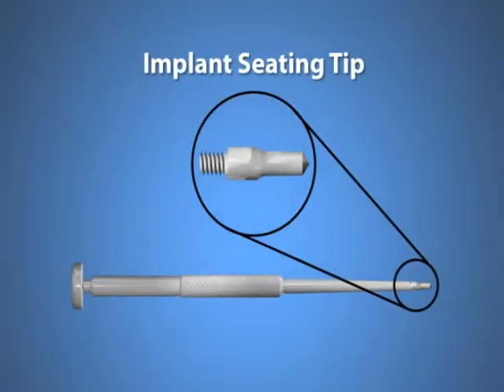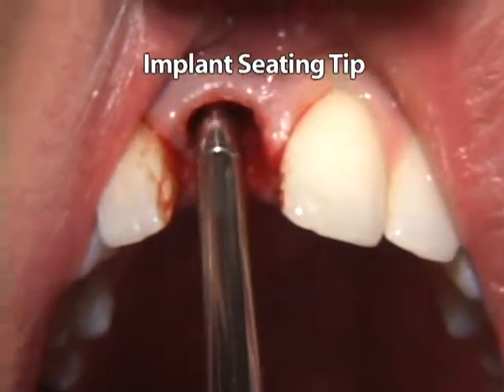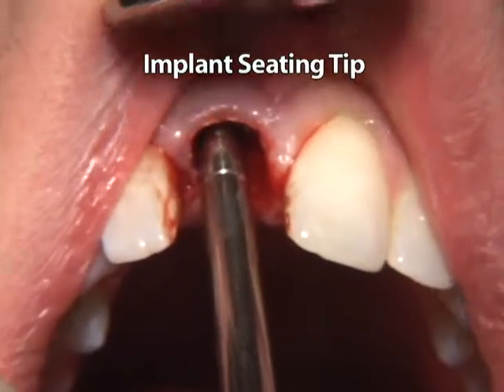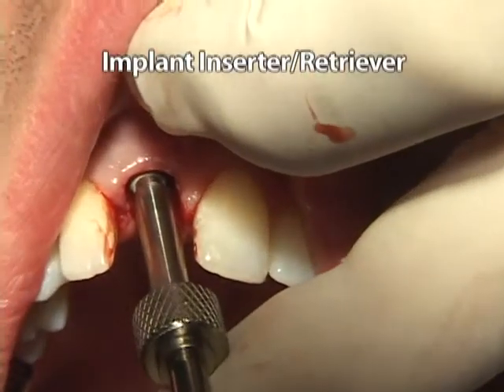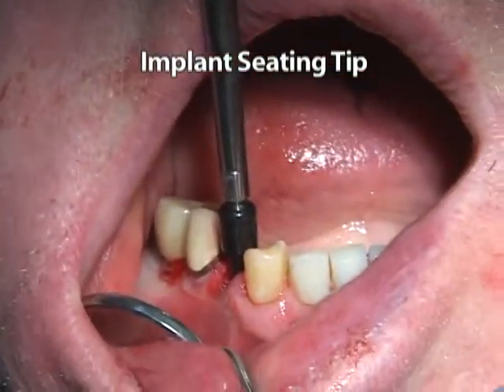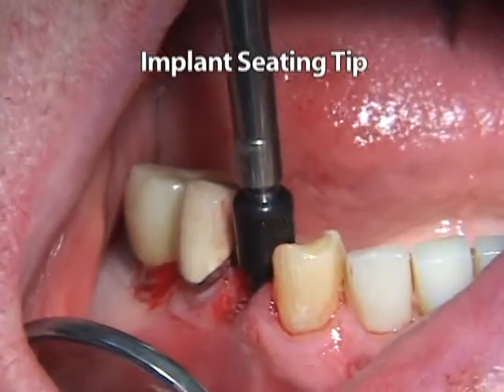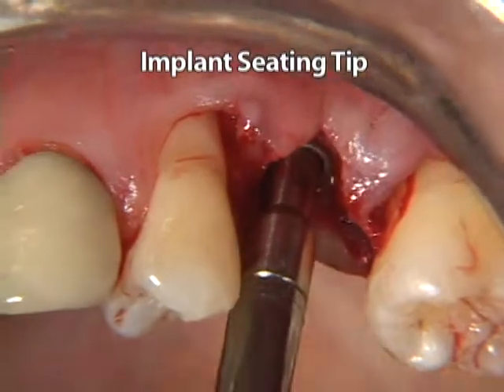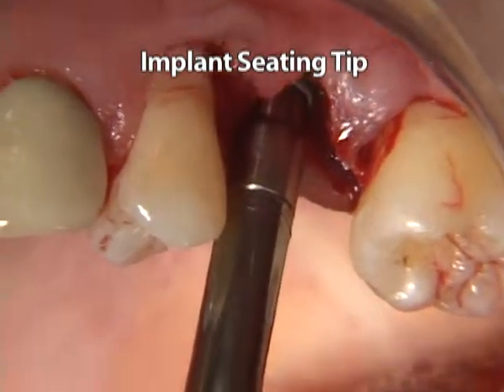After its initial insertion with a twisting and pushing motion, the blood-wetted implant may be definitively seated by tapping on it with either an implant seating tip or an implant inserter retriever instrument attached to a straight or offset handle. The implant seating tip may be inserted into the handle of the black polyethylene plug, or, alternatively, it may be placed directly into the well of the implant.